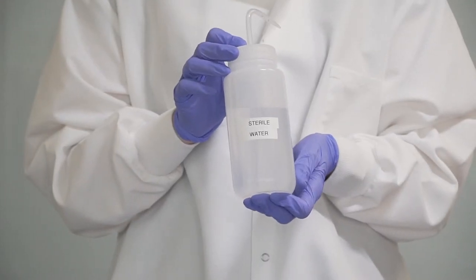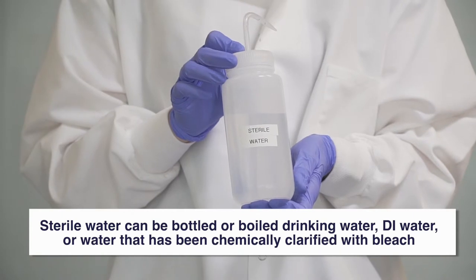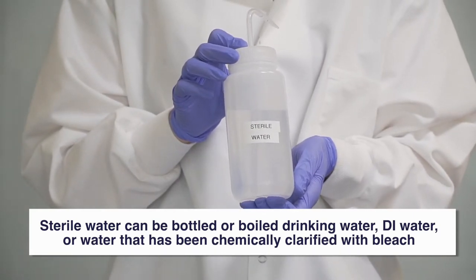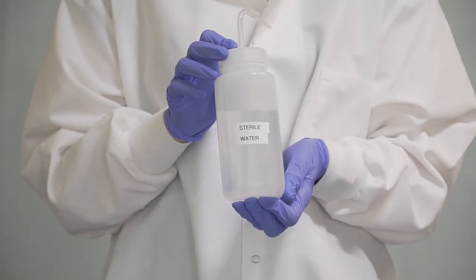Your third bottle should be filled with sterile water. Sterile water can be boiled, bottled drinking water, DI water, or water that has been chemically clarified with bleach.